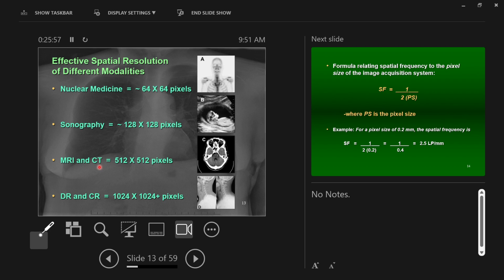We're going to put them in the CT scanner first, right? CT scanner is going to give them a lot of radiation, but have similar detail, right? But we're going to put them in CT first because it's cheaper and it's quicker. We want quick and cheap first to get quick and easy answers, and then we want to put them through the more complicated equipment. Now, a similar answer to why you would do plain film imaging before MRI: it's to get the quick and easy answer first, see how much you can answer with the quick and cheap way, and then try to do things a little more expensively.